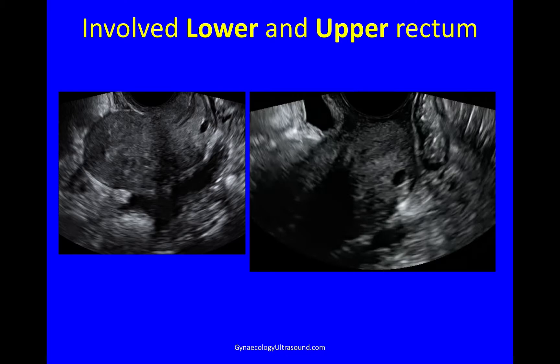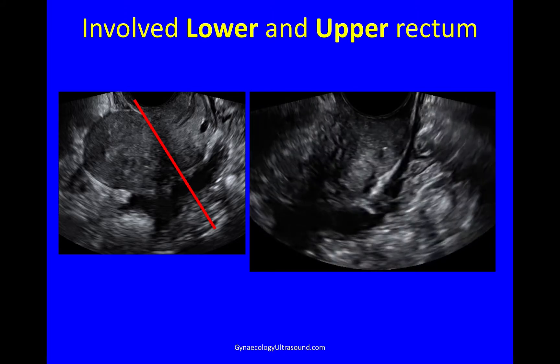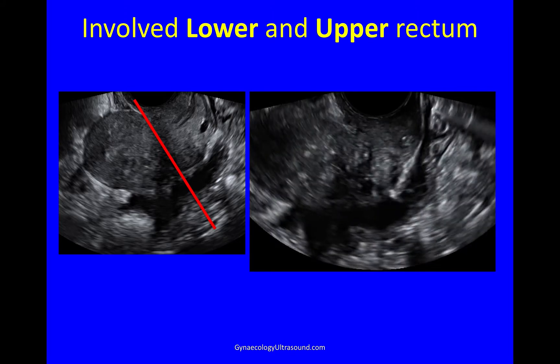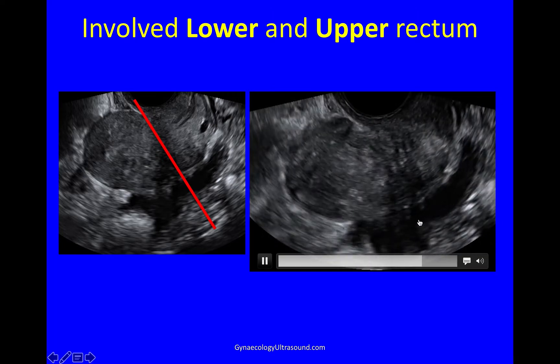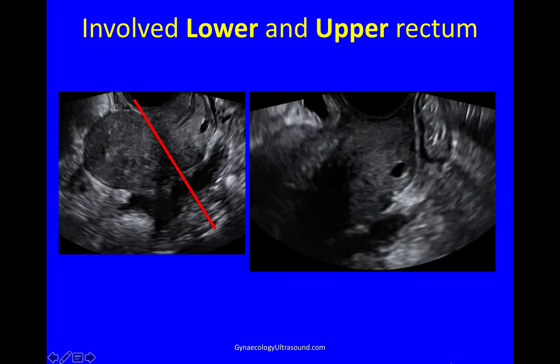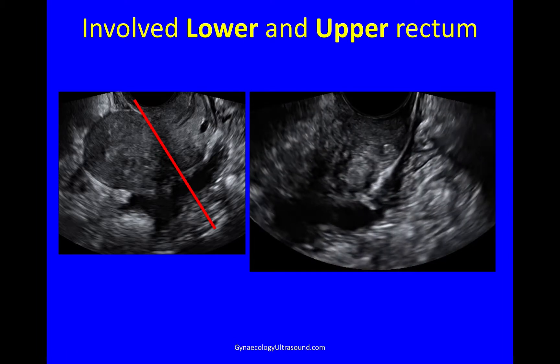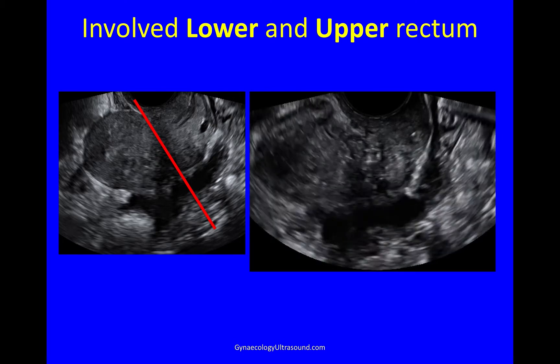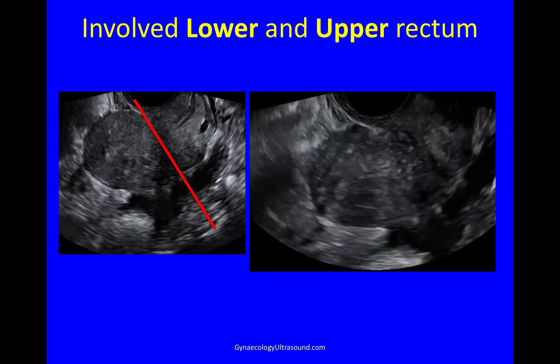This is an example of involved lower and upper rectum. Looking at the picture — uterus in the longitudinal plane — draw that line of bladder, internal os, torus, and you can see that this bowel nodule affects both the level below this line, below the torus, which is lower rectum, and above it, which is upper rectum. There's the probe going into the posterior fornix — you can already see the bowel nodule; it's very large. Coming into the posterior fornix, you can already see dense fibrosis behind the cervix and an attached nodule which stretches from lower to upper rectum.